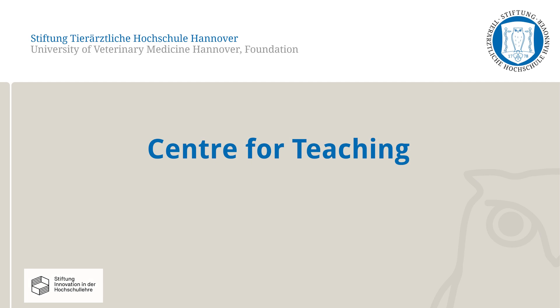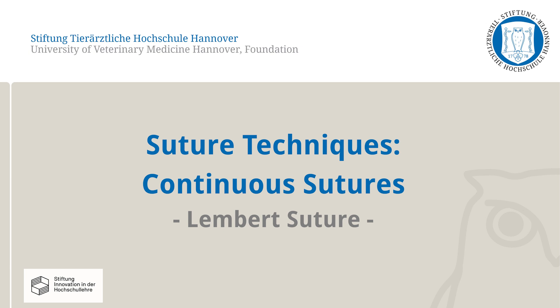In this video, the Centre for Teaching at the University of Veterinary Medicine Hanover will demonstrate the placement of a continuous Lembert suture. This video will focus on the technique of the suture.